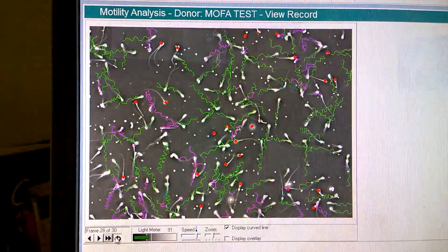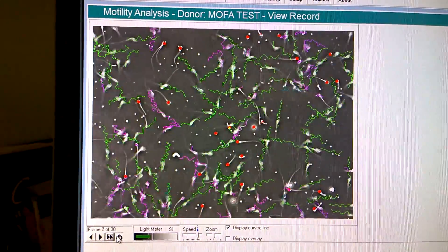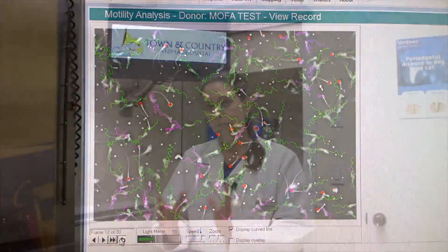What the CASA does is it takes the subjectivity of a semen evaluation out. So instead of just looking at it and saying it looks good, it actually breaks it down — the computer evaluates seven six-second strips of semen motility and then takes an average motility, total motility, progressive motility. It also allows us to take pictures of the sperm and evaluate their shape, or what's called morphology.